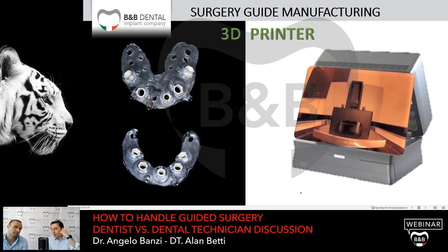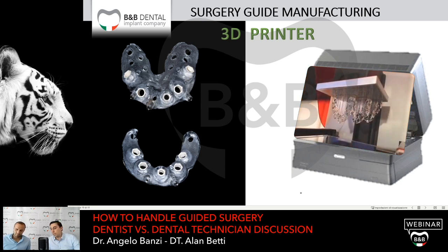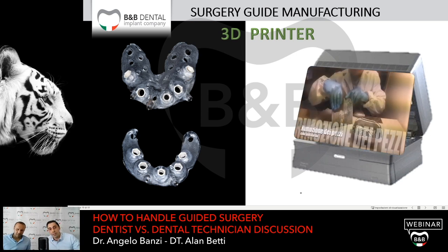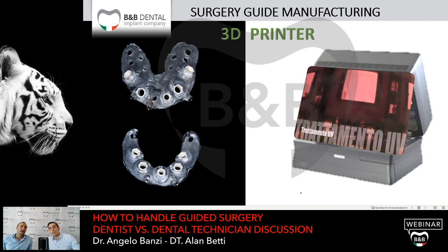Not much advice on it, because the 3D printers on the market today are all precise, and there isn't much problem. But I'm a dentist, and I want to be sure that the technician is going to use a good, precise 3D printer.